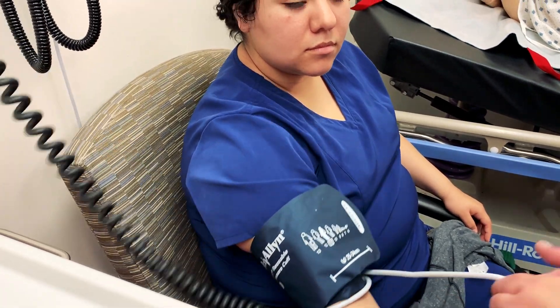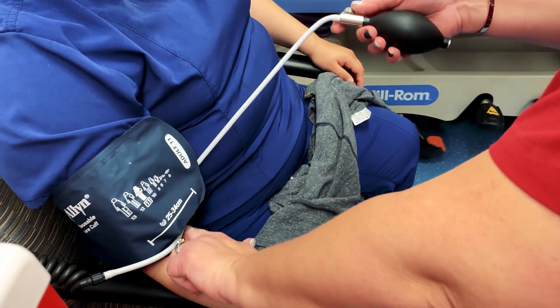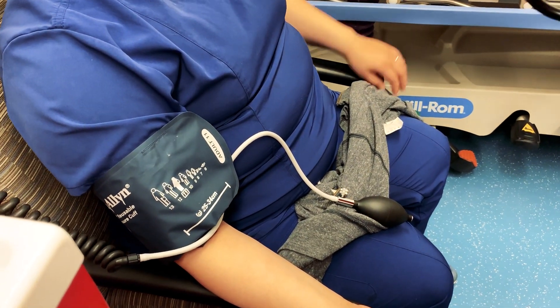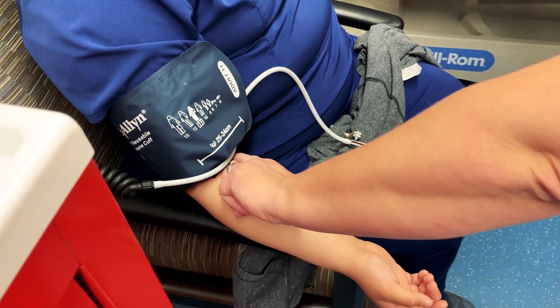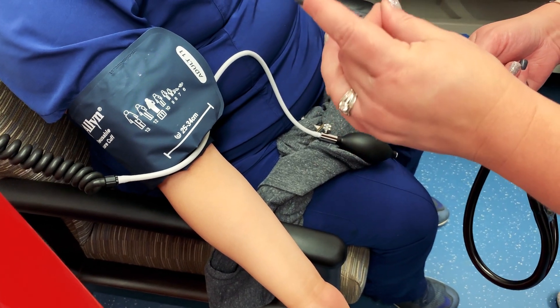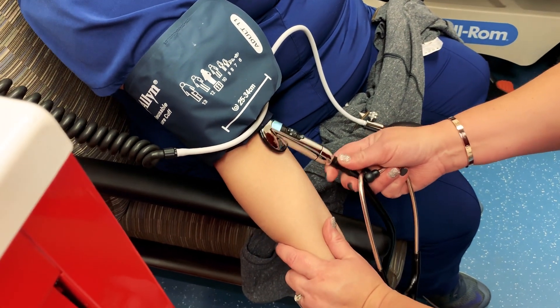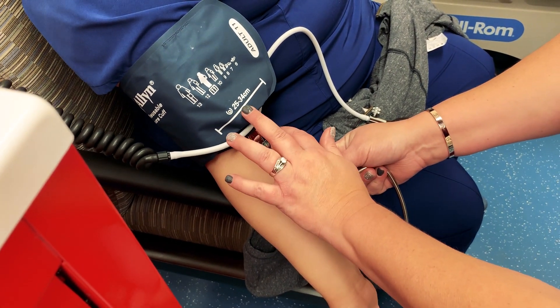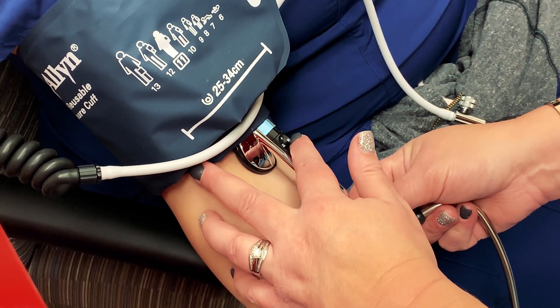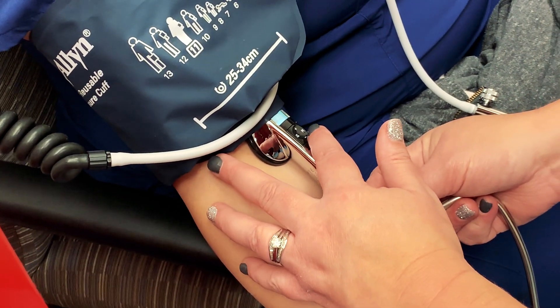Have the patient relax their arm. I'm going to put my valve and the bulb down. You're going to put your stethoscope on and place it over that pulse point, and you're going to hold it with your fingers — not your thumb — so that you don't pick up the radial pulse in your thumb. Place your stethoscope there.